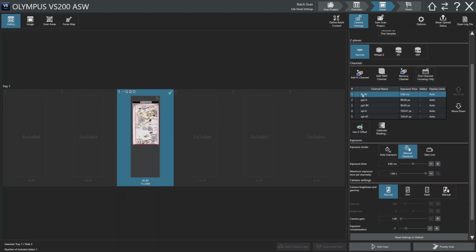Be sure to have the reflected light at the top because this is the channel that will be used for measuring the focus map. The distancing and the focusing is much better achieved when you look at the surface of the sample. Although you cannot necessarily put it in the final image, so if you click here, the image in reflected light will be used for focusing, but will not be included in the data tree when you finally have the file output.